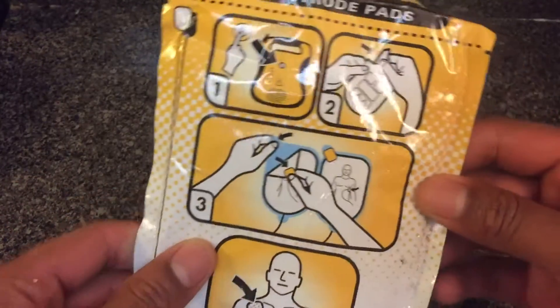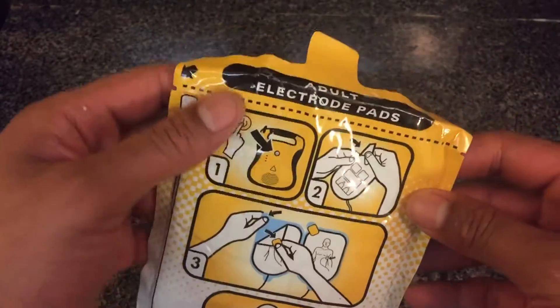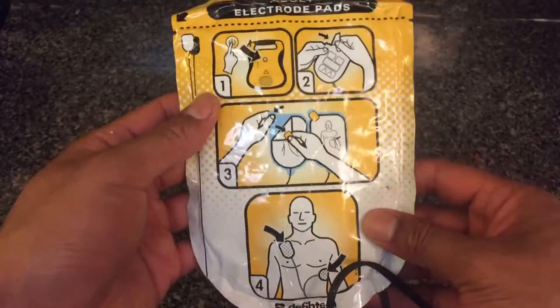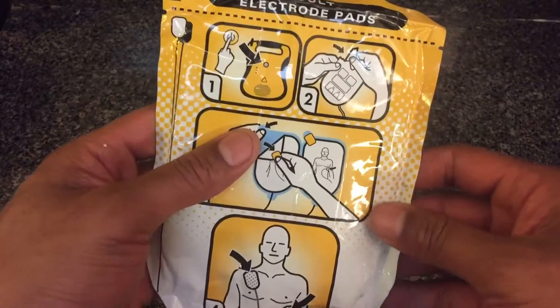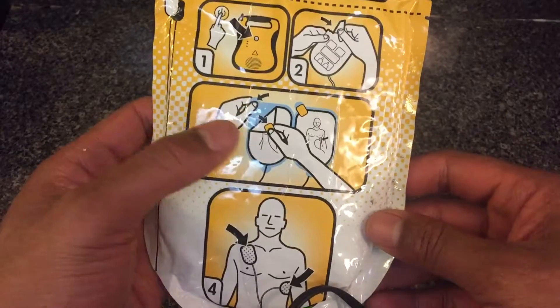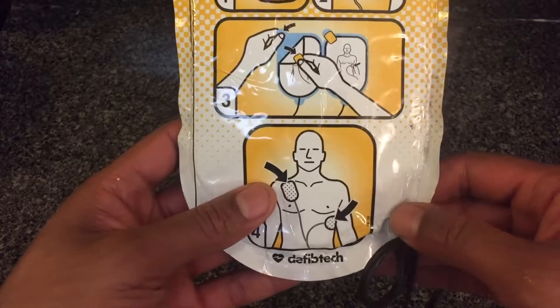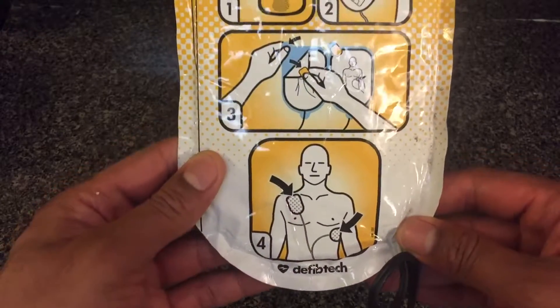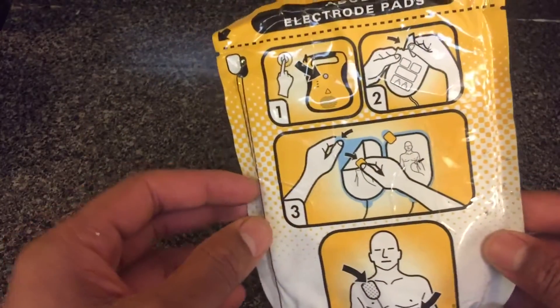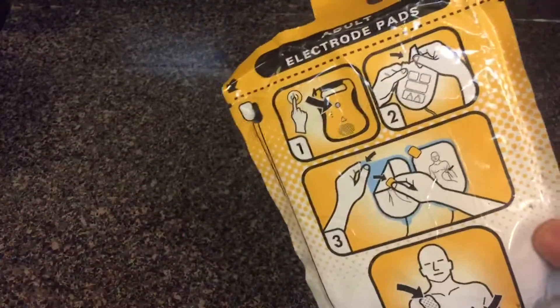This is a defibrillator pad from Lifeline's Reviver AED. This is the adult electrode pad. It shows you step-by-step instructions: one, press the button on the defibrillator; two, open the package; three, peel it back; four, place it on the victim — it shows you where to place the pads. The Lifeline by Defib Tech has very simple instructions to help you save someone's life.